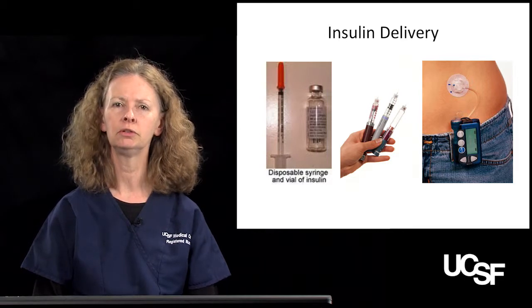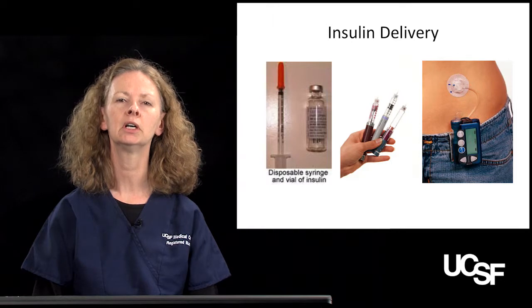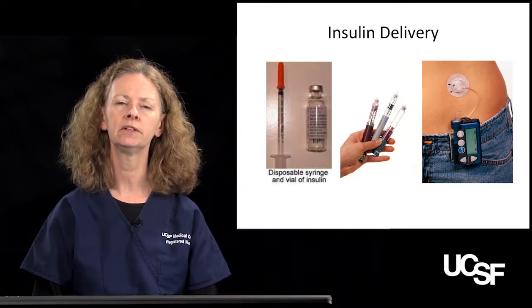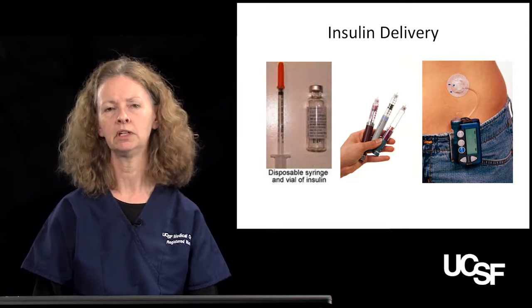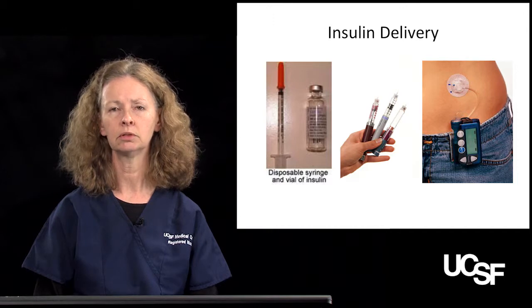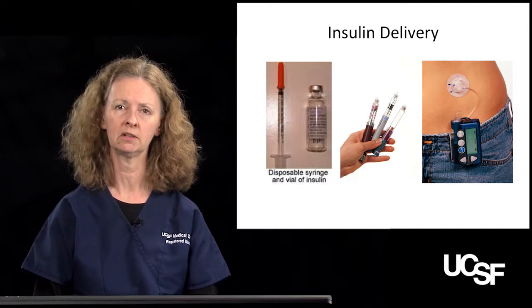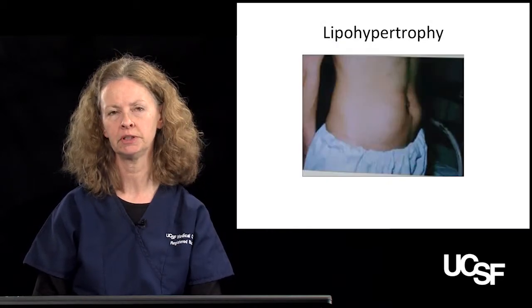So I'm going to show you a couple of the different pumps that are available on the market. I think that it requires a fairly savvy patient to really take advantage of the options that a pump can allow, and an experienced provider to help to figure out what the settings on the pump should be. So the last thing I'm going to cover in this segment is lipohypertrophy.